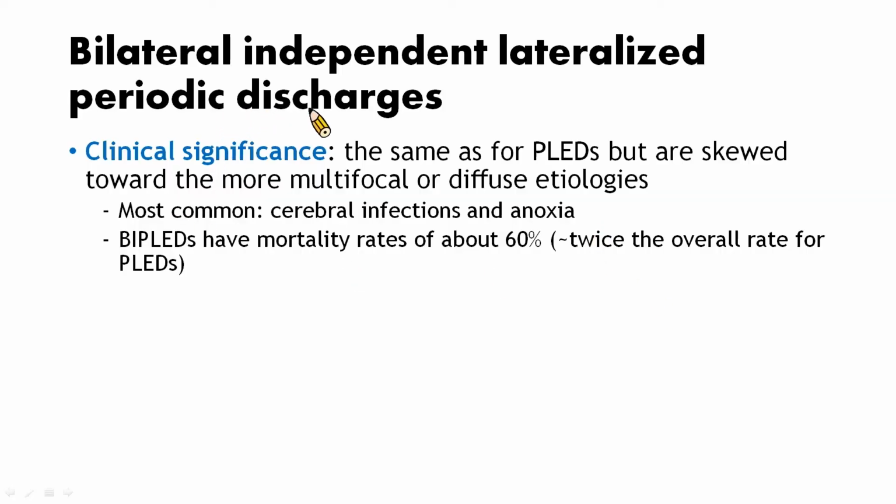And bilateral independent lateralized periodic discharges have the same clinical significance as PLEDs, but they are skewed toward more multifocal or diffuse etiologies. The most common etiologies are cerebral infections and anoxia. BiPLEDs have mortality rates of about 60%, which is twice the overall rate for PLEDs.